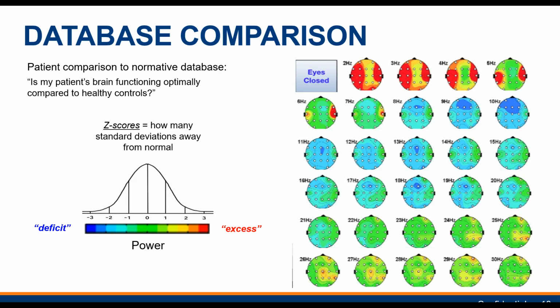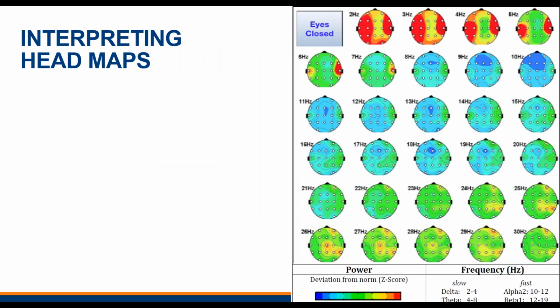It's super important in cases of neuroinflammation to really consider the region of the brain where neuroinflammation is occurring. And that's what's really helpful about doing this type of electrophysiology test, either in addition to or sometimes in place of your lab tests, because it's showing you where the culprit is, where this dysfunction is really occurring, which of course is going to link back to symptoms and really help you understand what's going wrong with your patient.